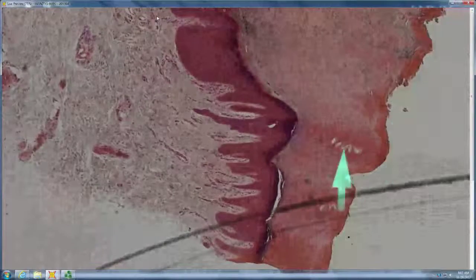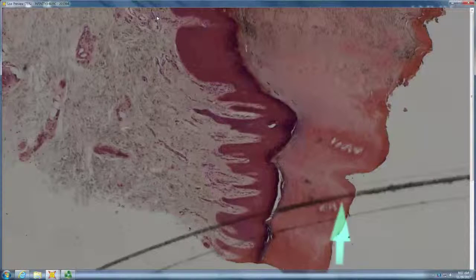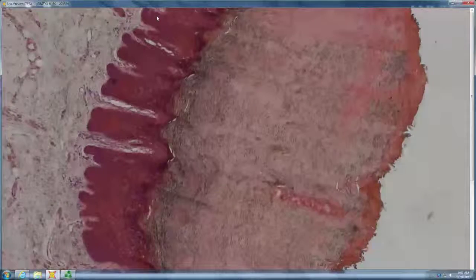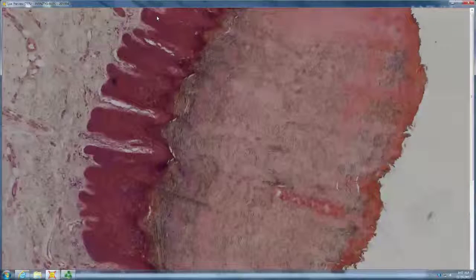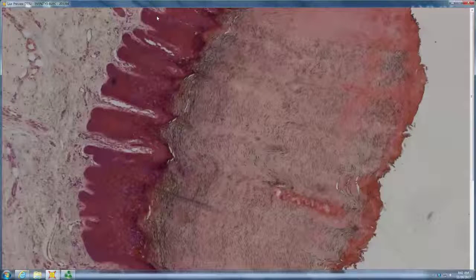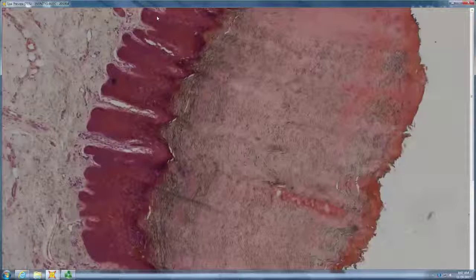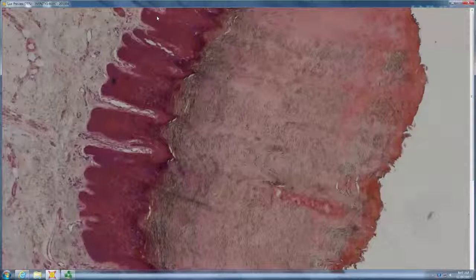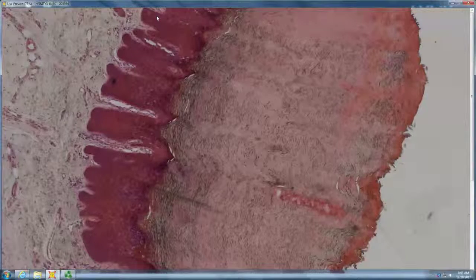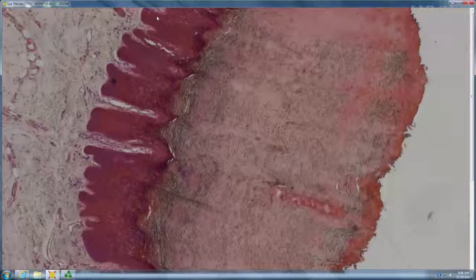Now it's on palm. You can see normal palmar corneum here. So what would this hyperkeratotic palmar lesion with EHK be? There is an epidermolytic variant of keratosis palmaris et plantaris. Okay. So this person would not have ichthyosis all over, but could have just isolated inherited KPP with EHK. Okay.